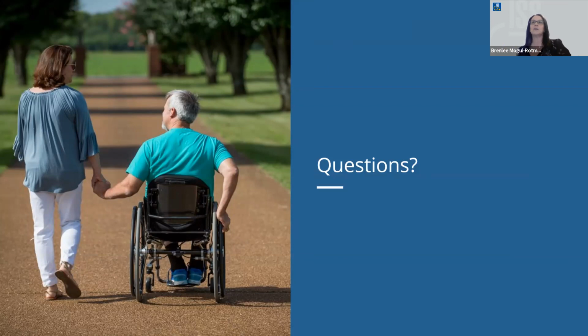I think it's important from our perspective as clinicians to give them the, if we do this, then these might be the implications if we do it this way. So if we have a taller back, it might get in the way a little bit of you propelling. However, if we go with a lower back, you might be able to propel better, but you might feel less stable. So maybe there's a training component there. Maybe there's looking at some adjustability in the mounting that we could move it up or down a little bit without losing that PSIS. So all of those things I would think should be considered. So Eleni, I don't know if you have something else that you would consider for that one.